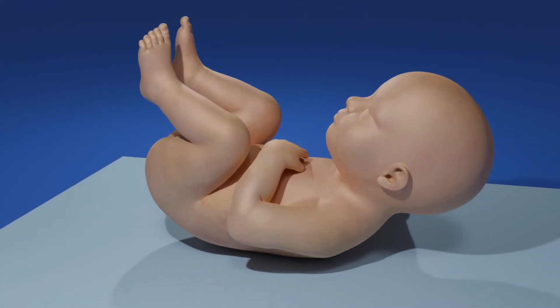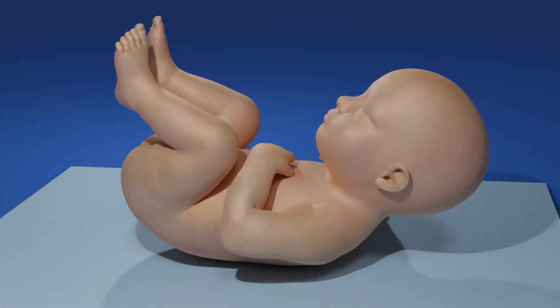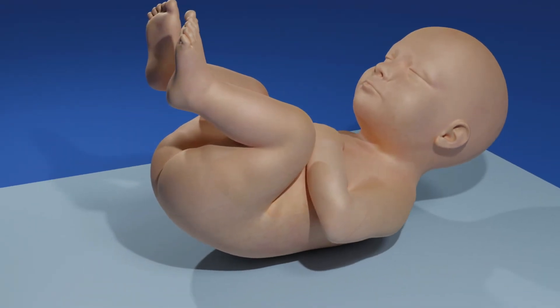If they are bigger, position them with knees bent and their feet flat on a surface. You may need another person to help hold their legs in this position. Place the empty basin next to your child.